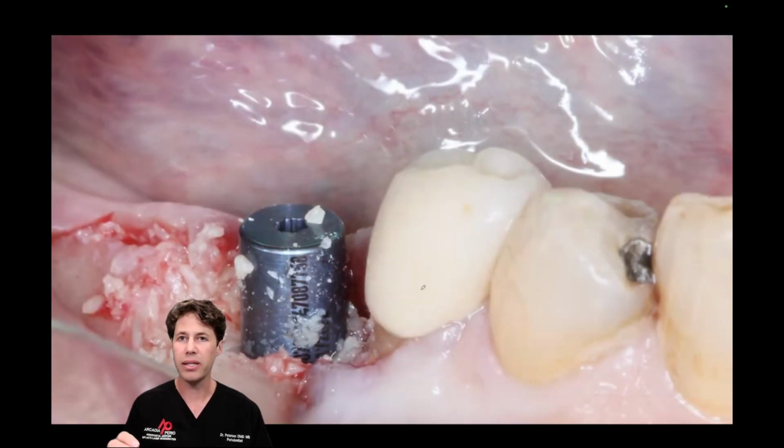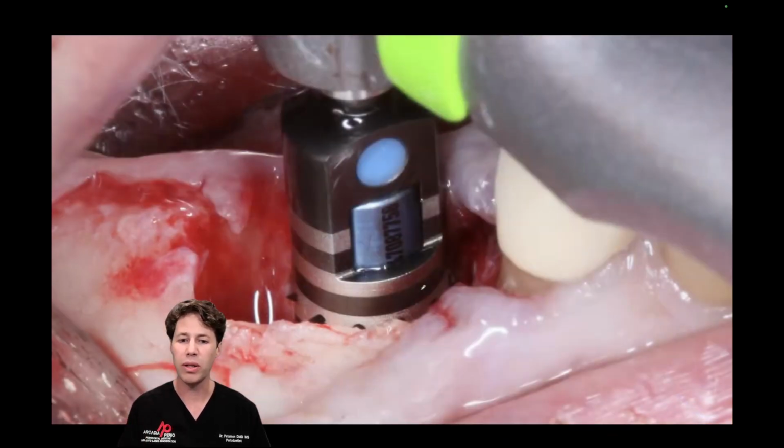So we place our protective bone mill abutment onto the implant. Nobel makes these bone mills. It comes with a protective abutment, just like a tall, narrow healing abutment. But then what this bone mill looks like is it fits passively over that abutment and you go until it seats fully. So that's what you can see here in the picture, I'm fully seated from the bone mill on top of the abutment.